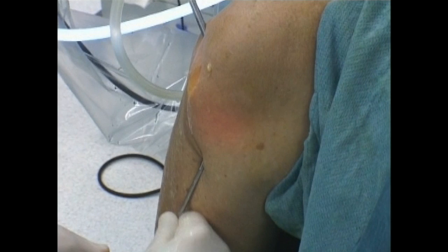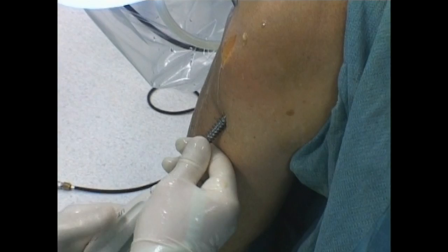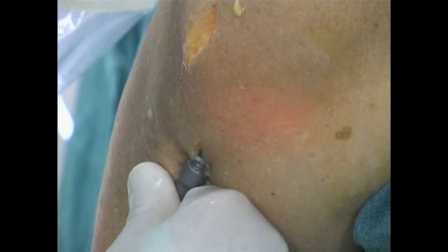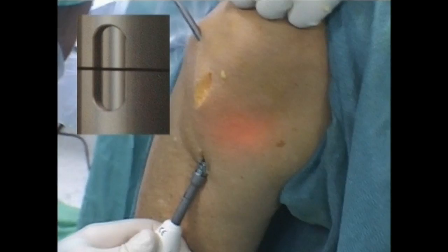The tibial pilot drill is removed. The introducer is advanced into the prepared tunnel until the tip of the introducer is flush with the tibial plateau. Once the threaded blade stop is engaged on the blade stop driver, it is advanced over the introducer until it begins to screw into the bone. The introducer is removed and the blade stop is screwed until it is two-thirds of the way into the tunnel. The driver handle and the introducer are reinserted. The laser mark on the introducer must be in line with the laser mark in the slotted window of the blade stop driver.